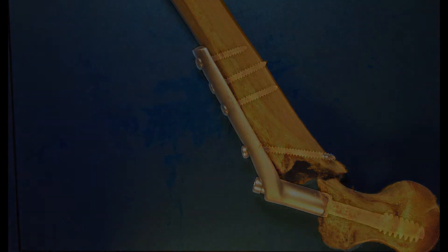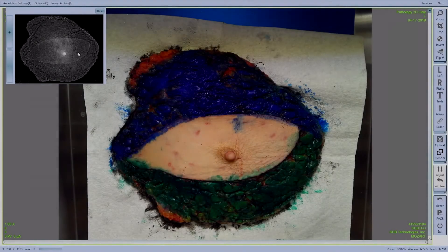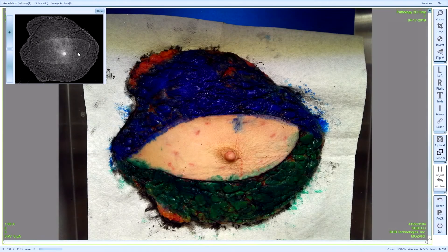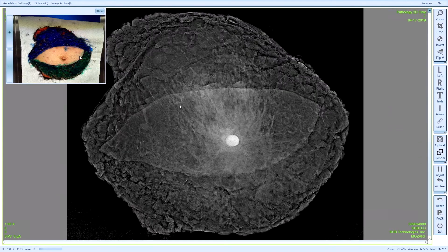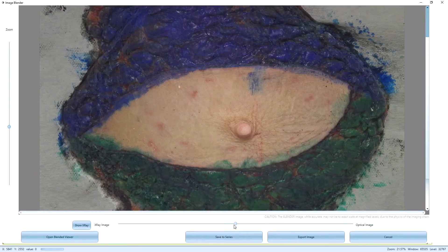Here is an optical image of a mastectomy specimen. Of course, this is what you see when you receive the specimen. You need to find the clip, but where is it? Looking on the x-ray, we can see it here. To find it on the actual specimen, I can blend the x-ray with the optical. Here it is.